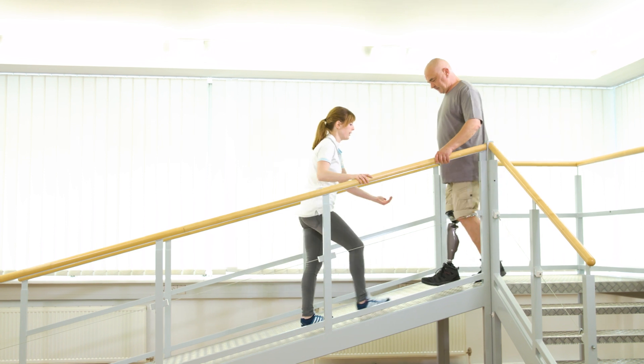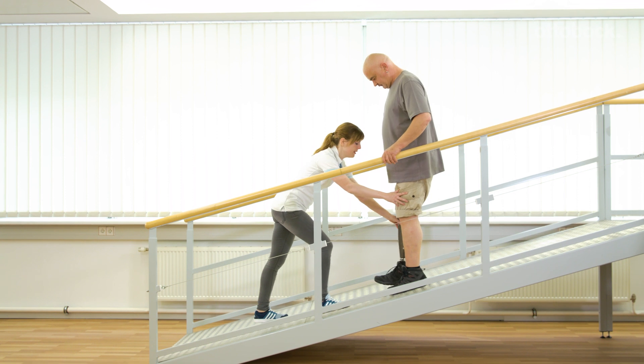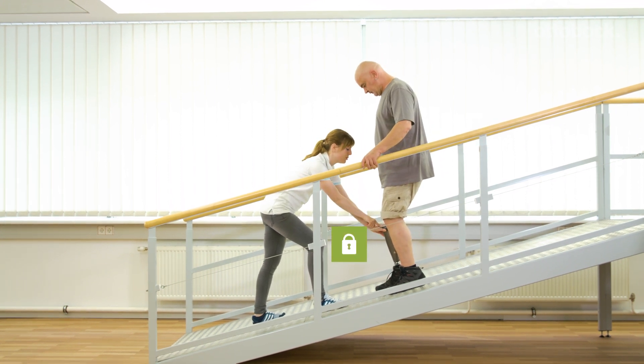Stopping and standing using the stance function is now repeated on the steep slope. The upper body stays upright, and Gerhard can fully load the prosthesis.